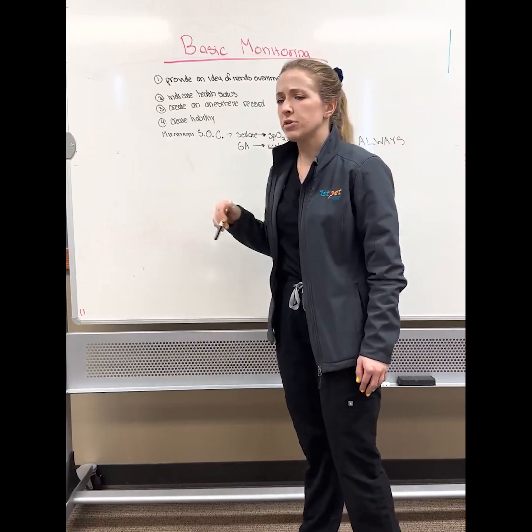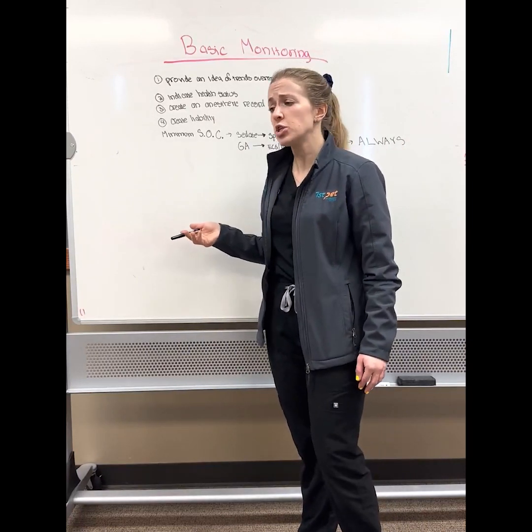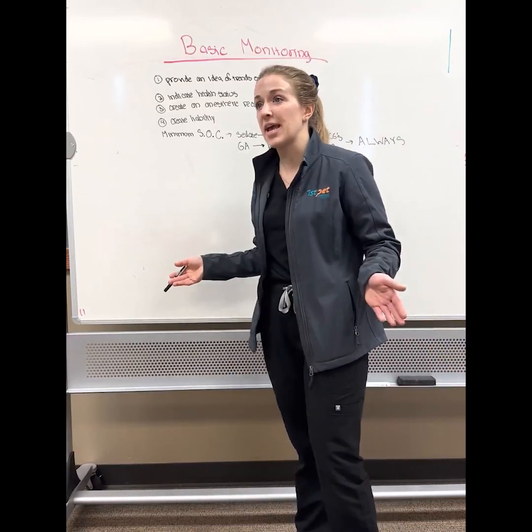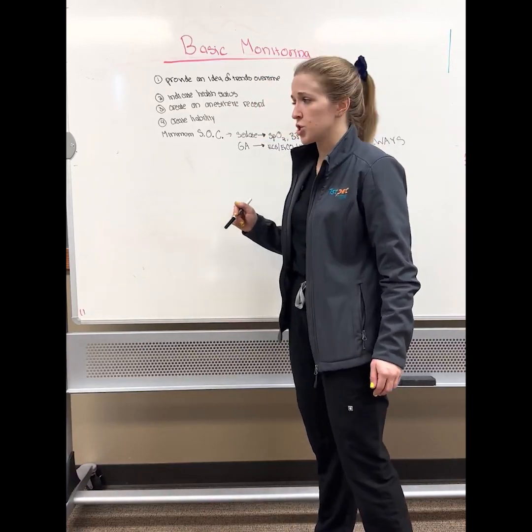And if for any reason there is a gap, like there was a 911 emergency, or you had to do an intervention with the patient that led to a gap, or you moved the patient to a room and there was a 10-minute gap in the record, make sure you made a note of that, so that way you're going to be covered in case of an emergency.